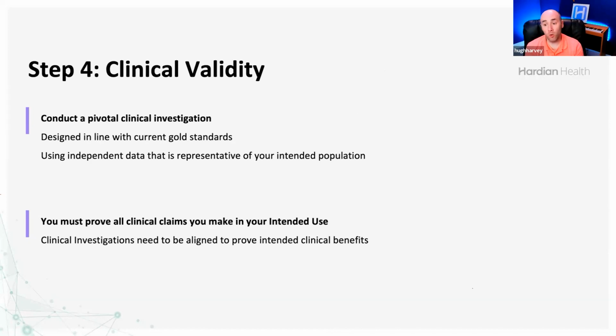And you should also do pragmatic searches, as Ankit briefly touched on. So it's perfectly fine to do just normal Google searches for adverse events that might have appeared in the news. For instance, if the Apple Watch has got something wrong and it's made it onto BBC News, you could put that into your search and say, look, there are some public reports of adverse events, and that's perfectly acceptable to include.